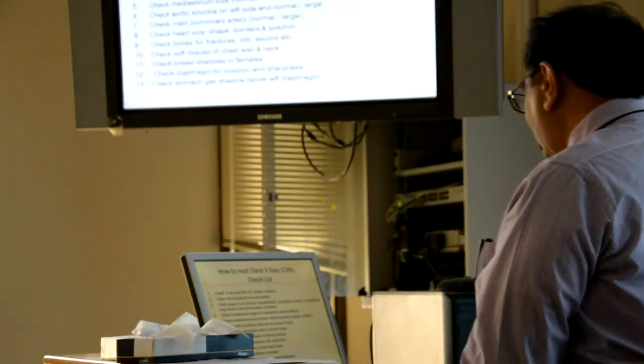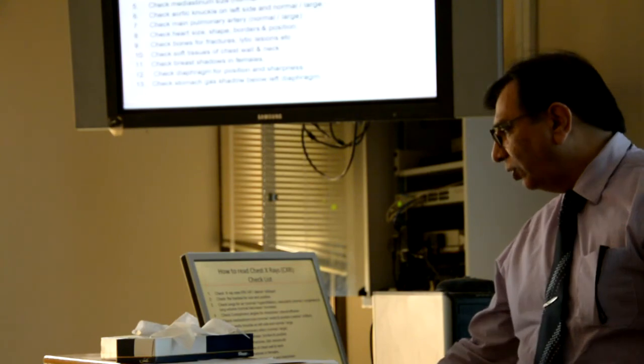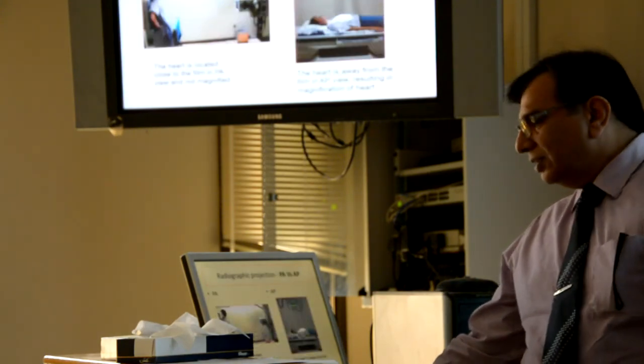Okay. So this is a huge list. It seems to be difficult at the start, but once you practice, make it a habit to go through these checklists one by one, then it won't take more than a minute or so for each film.